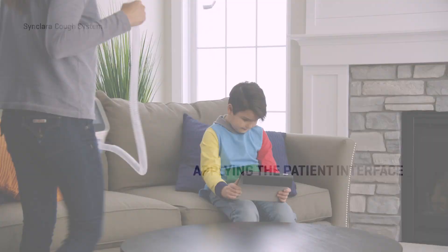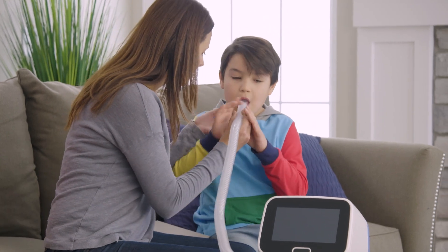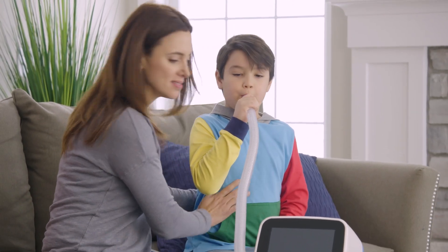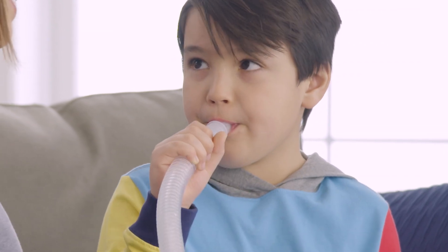If possible, have the patient sit in an upright position. Before beginning therapy, place the patient interface into position on the patient. Make sure the patient maintains a tight seal on the face mask or mouthpiece during the therapy.